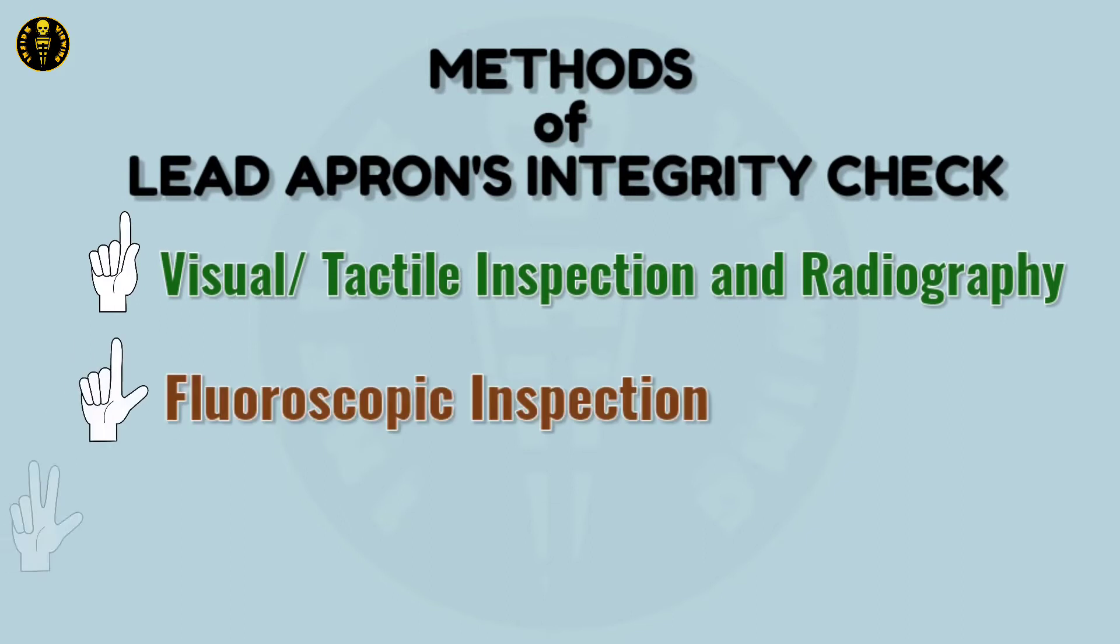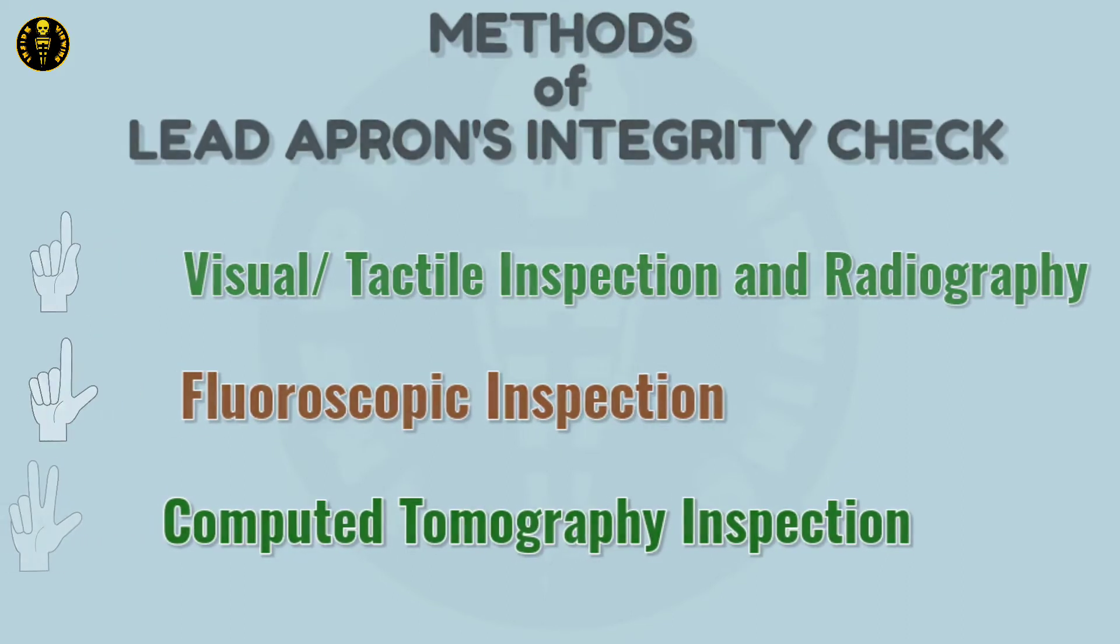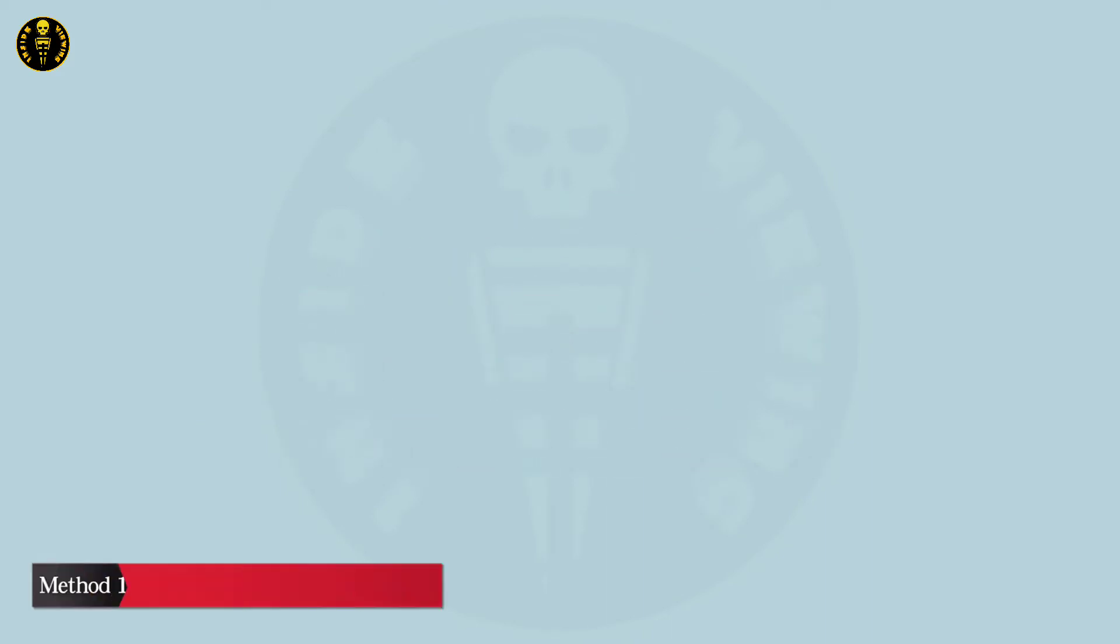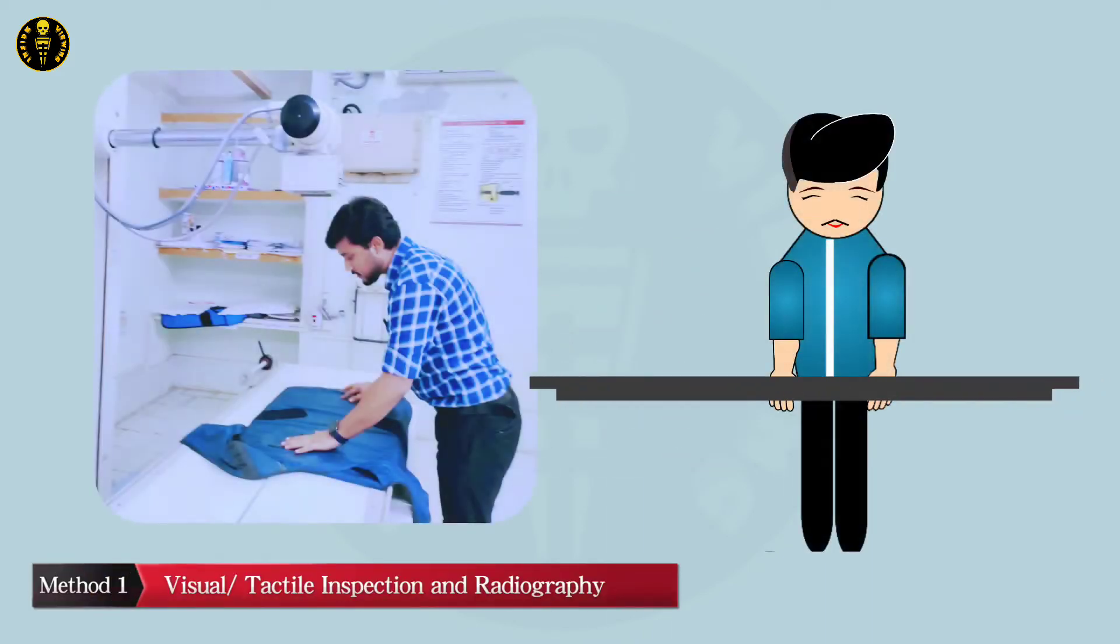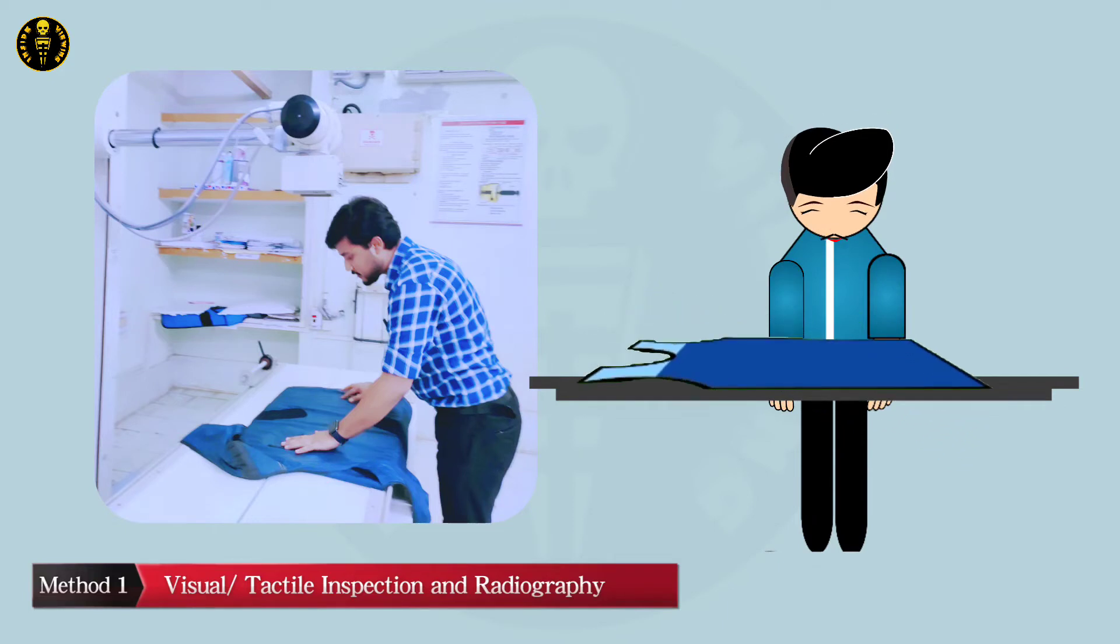Now I will tell you three simple methods to check the integrity of the lead apron or other protective garments. For visual inspection, lay out the apron on a clean flat surface and visually inspect for any tears, perforations, or imperfections.